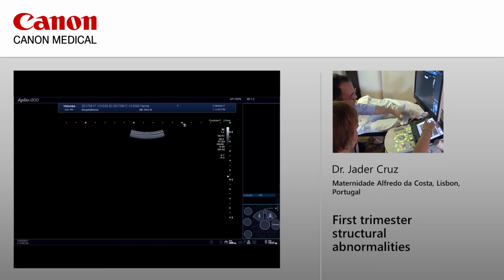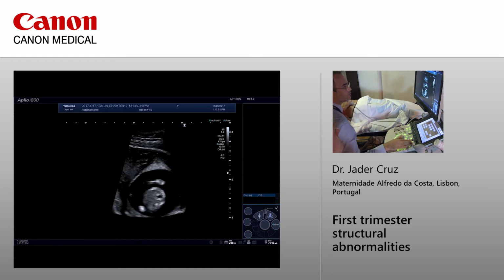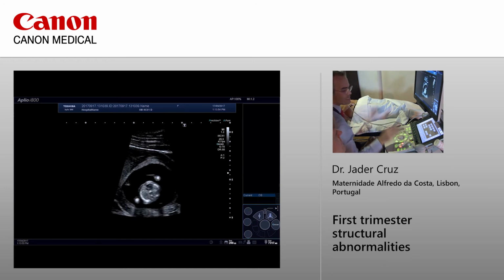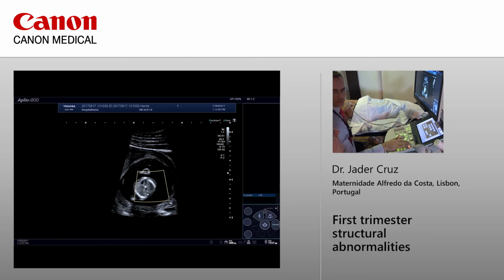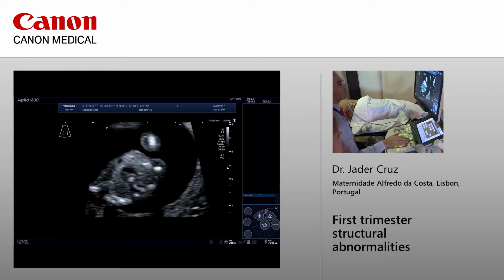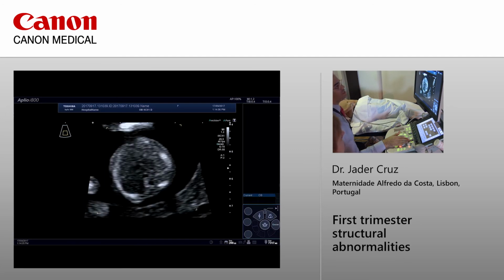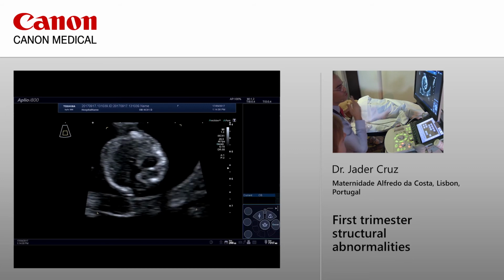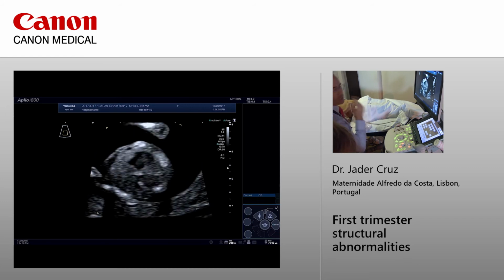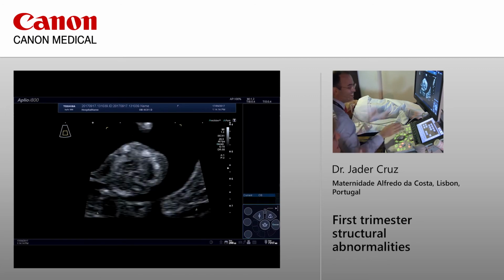Is it a different probe? Yeah, I just changed. Well, the SMI works in every probe. Am I lying? No, you're not lying. I'm not lying. SMI works in every probe. I just like the presets of this probe more. And also, because, is that something I can say? I don't know yet, because you haven't said so. No, say it.